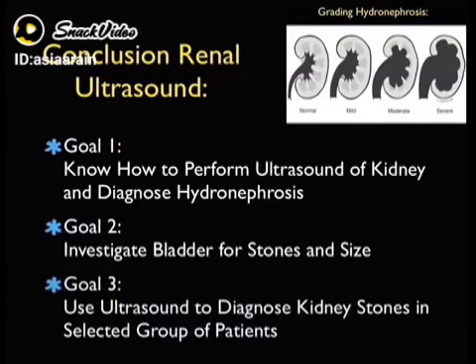We can also get a sense of bladder size on bladder sonography, and using Doppler, we can look at the ureteral jets. Our overriding goal for this module is to use ultrasound to diagnose kidney stones in a selected group of patients as an alternative to CAT scanning.